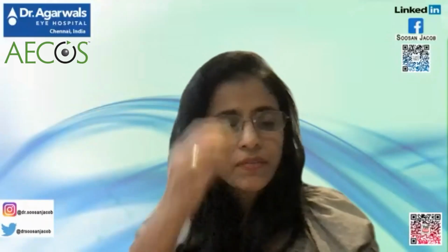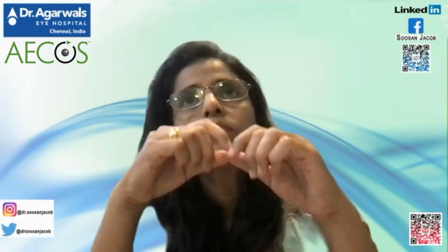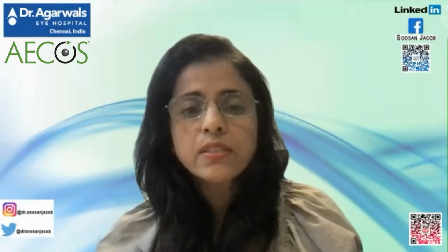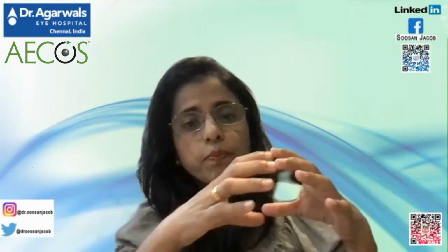Yes, actually, that is something that we are working on now. And you're right, CARES gives you this freedom. And I think that is something that's very important. With synthetic segments, even though you do have progressive thickness synthetic segments, they're very standard because they start at one end at one thickness, and then go continuously across to the other end. And you get them in only certain standard thicknesses. You get them either clockwise or counterclockwise, and then you have to have this entire inventory with you for different patients. So it really frees you up from all that. For some patients you'll want the length of the segment that's uniform thickness and the length that's tapered on one side or both sides. You might want to customize so much.